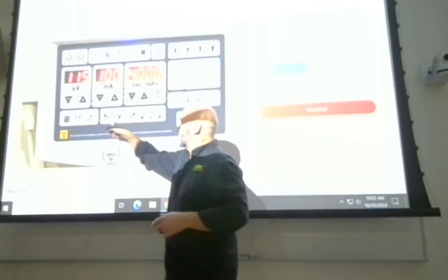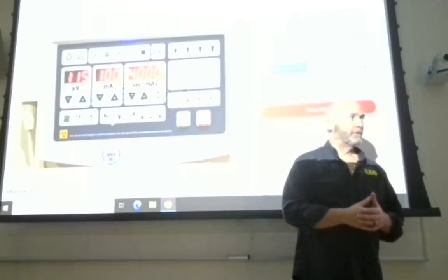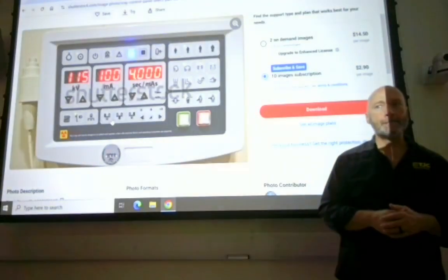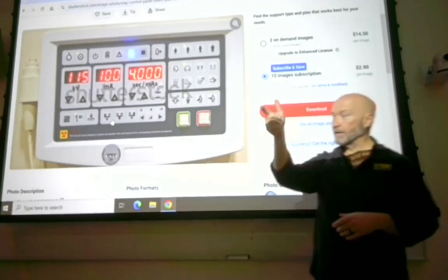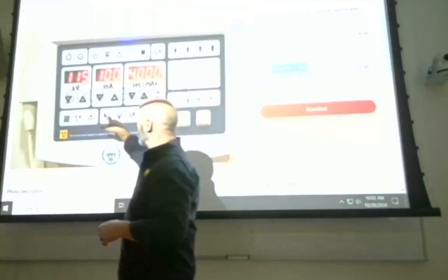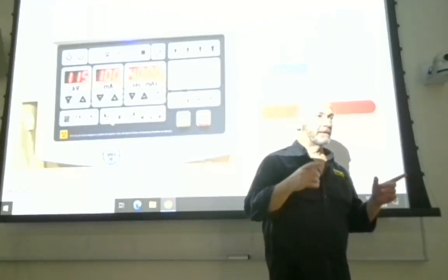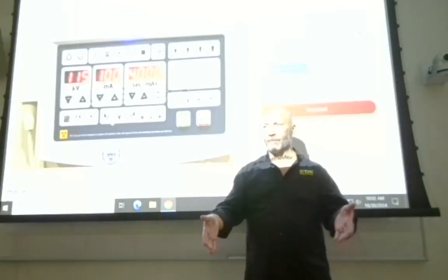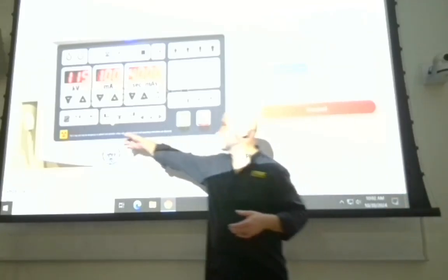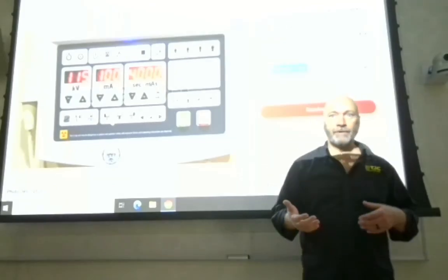So these three things down here, you ever seen anything that looks kind of like those? What's that? On the IR. That's exactly what they are. Those are representative of the radiation detectors inside your wall bucky. You don't generally see that on a table bucky, but those are representative of what you see on the wall bucky.